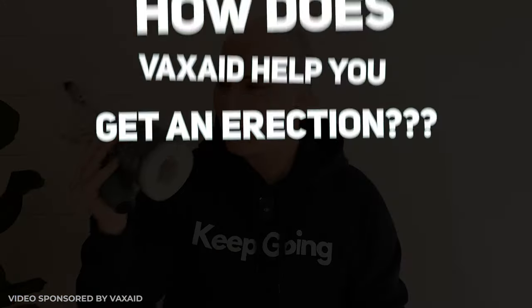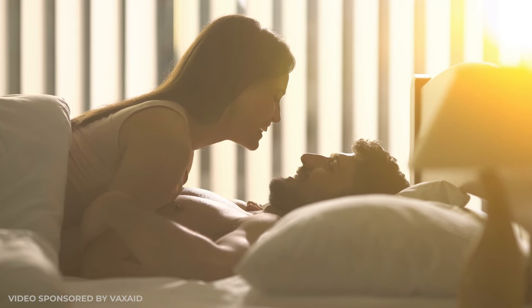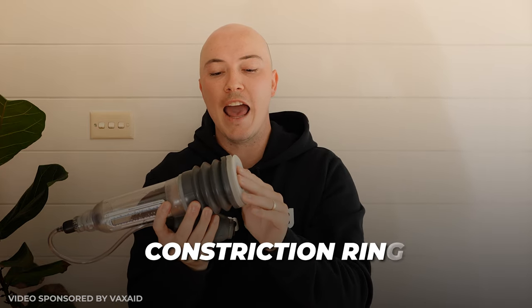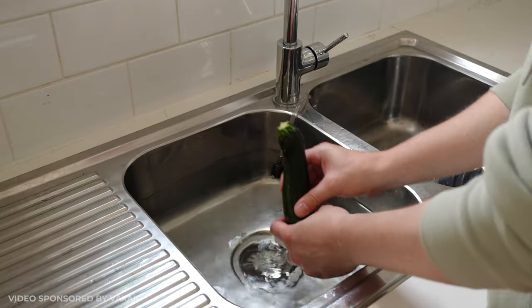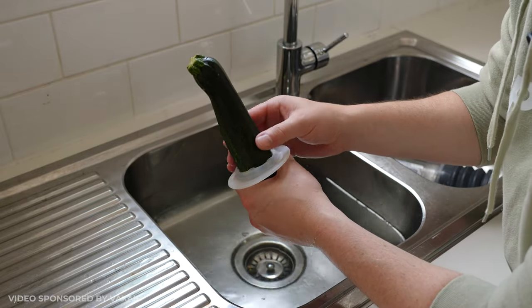You're probably thinking: that's great, but how does this help me have an erection when I don't want to use the pump — such as when I want to be intimate with my partner? The answer lies in this constriction ring. You place this ring onto the end of the pump before you start. This ring traps the blood in your penis, meaning that once you take the pump off and release the pressure, you are left with a firm erection to go and do as you please.